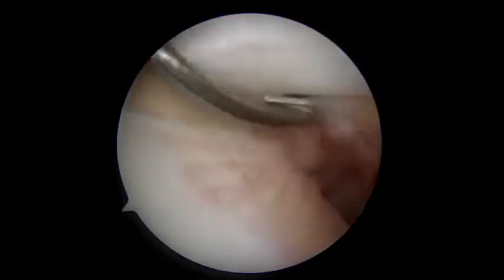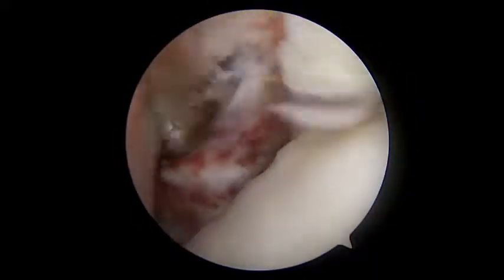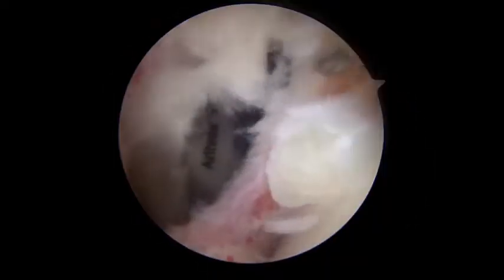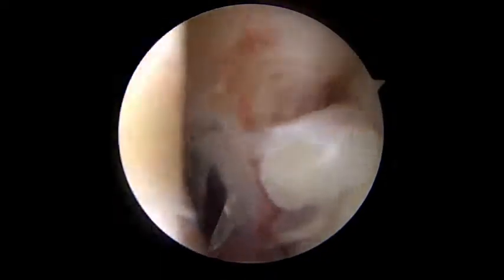The elongated biceps tendon is released from the superior labrum with arthroscopic scissors to facilitate subsequent subpectoral tenodesis. The lesser tuberosity footprint is freshened with an arthroscopic shaver. A 4-centimeter passport is positioned within the anterior portal to facilitate passage of instruments and suture.